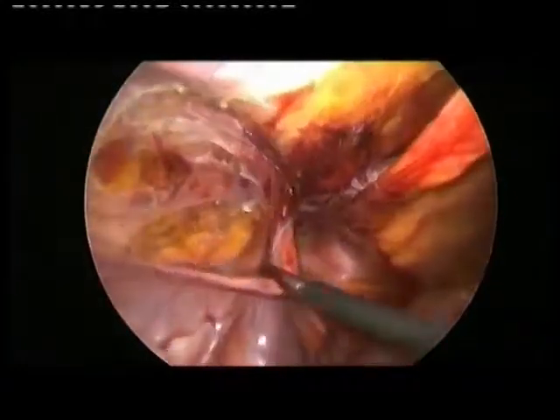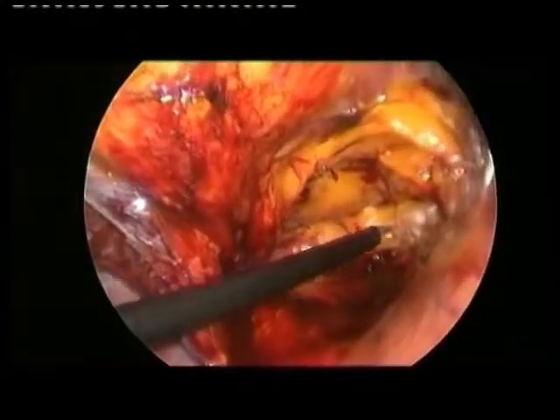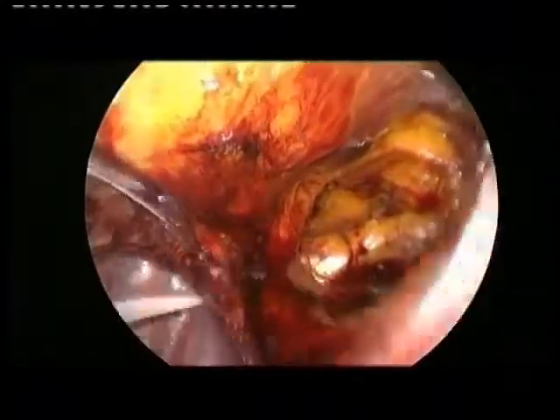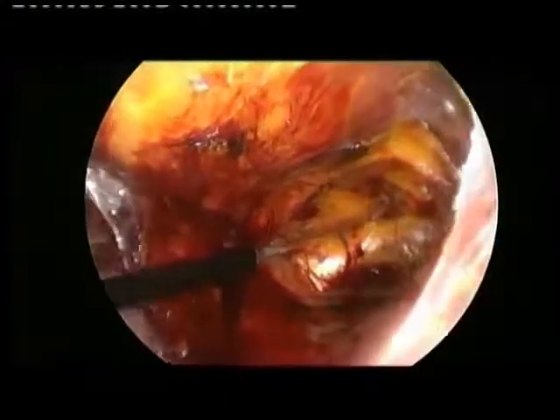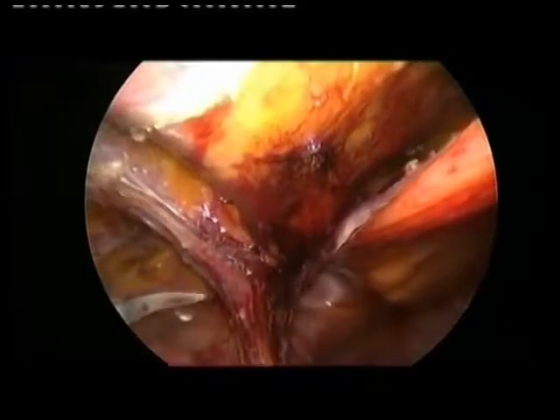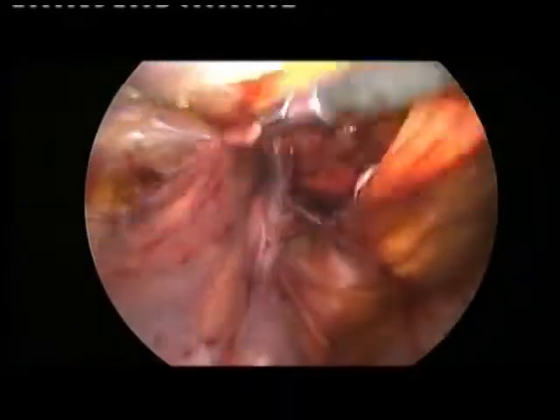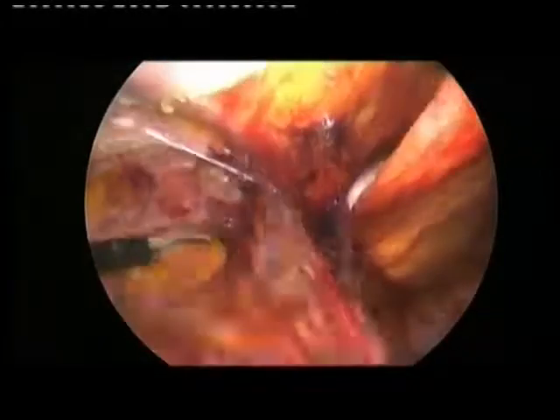This is the sac that I'm going to reduce, but before I reduce the sac, I have prepared the medial fossa and prepared the Cooper ligament, and the transversalis fascia is here, okay? Here there is the direct hernia that is not present in this case. And you see, I confirm that this is a crural hernia because the hernia is below the inguinal ligament that is here, okay? So this patient has a double hernia, and probably if this kind of hernia had been done by open surgery, maybe there is the possibility of an immediate recurrence. We call it a pseudo-recurrence. So I'm going now to reduce this sac.